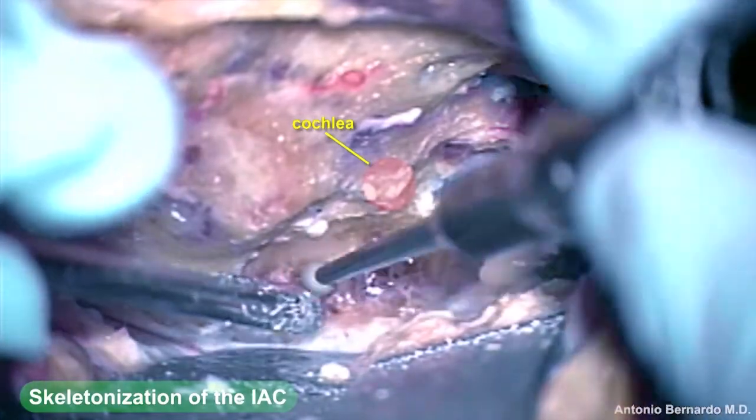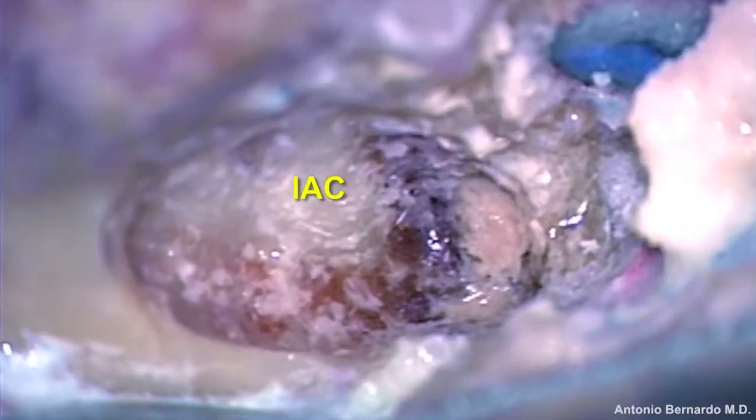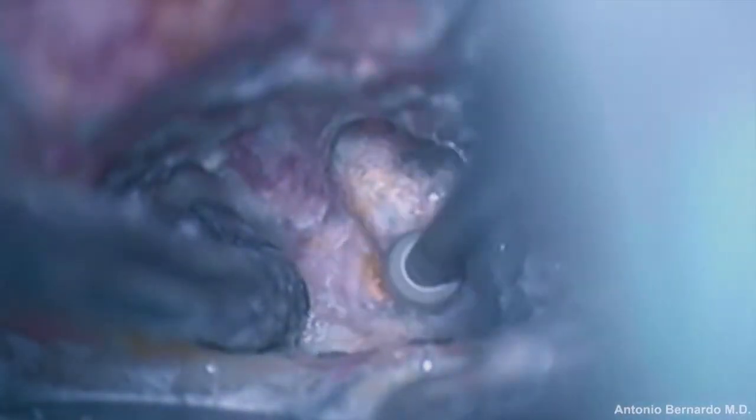As the dissection proceeds posteriorly, the consistency of the bone changes from cancellous to compact as any other skull-base structure. As the dissection approaches a neurovascular structure, the consistency of the bone changes. And finally, when the dura is approached, the drill can be changed to a diamond burr, and the internal acoustic canal is skeletonized circumferentially from posterior to anterior, uncovering the dura on the internal acoustic canal.